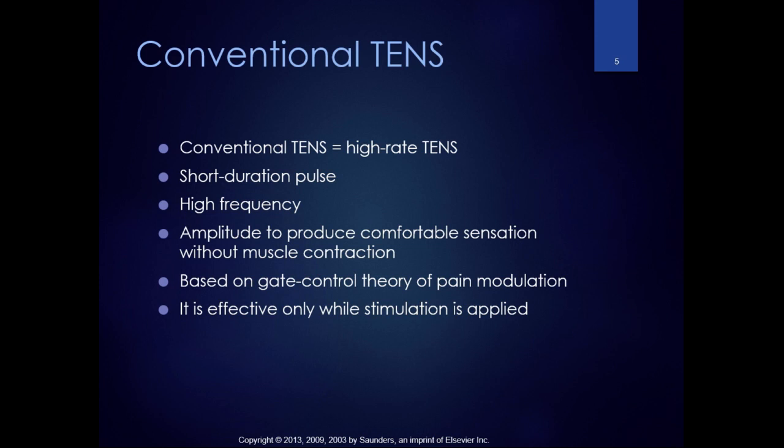But a TENS unit, you could actually put it on someone who has chronic back pain, they could put it on while they're cleaning the house or wear it all day, or wear it at work.